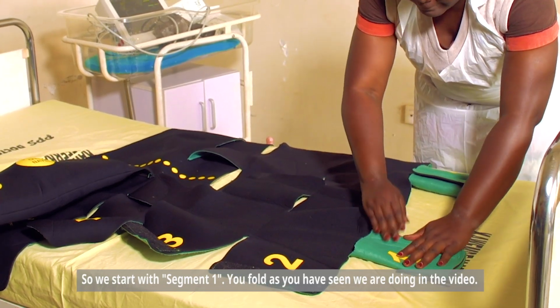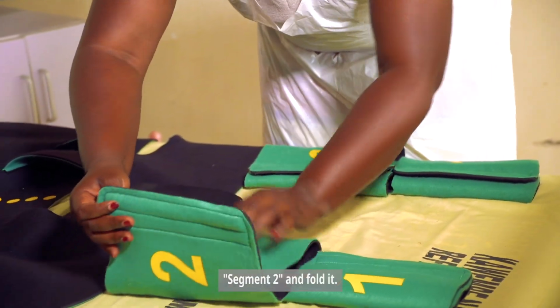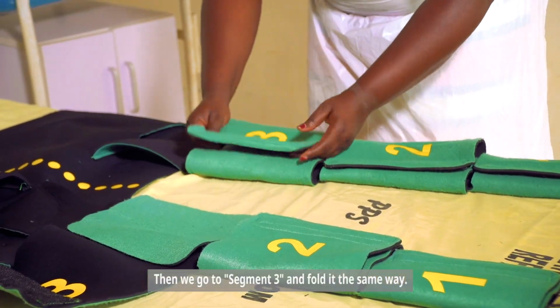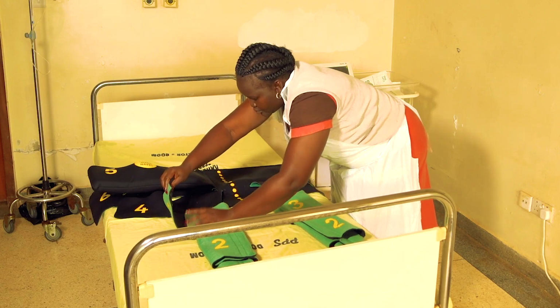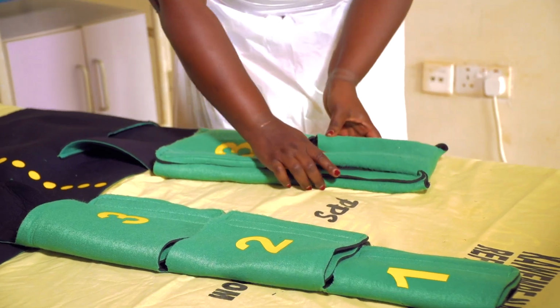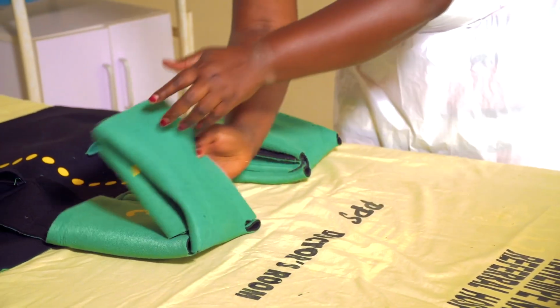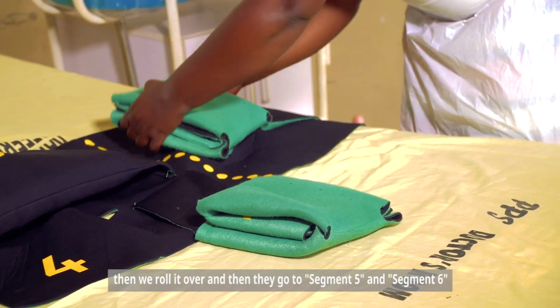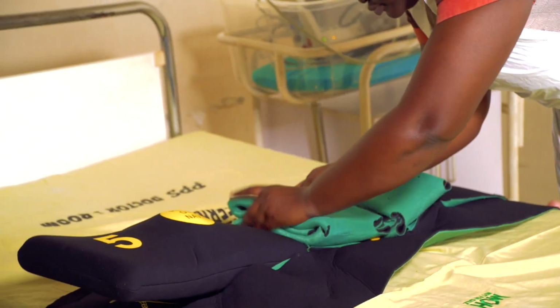You fold as you're seeing we are doing in the video, segment 2, and fold it. Then we go to segment 3 and fold it the same way. Then now we bring segment 1 to segment 2, and then both 1 and 2 to segment 3. Okay. Then we roll it over, and then they go to segment 5 and 6.